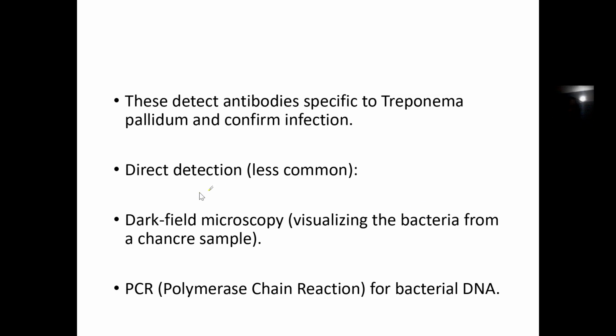Yes, we also have the direct detection, where you have the dark field microscopy, which can visualize the bacteria directly. Then also polymerase chain reaction, which is very specific for the what? The bacterial DNA, can also help you to pinpoint that that particular bacteria is there.